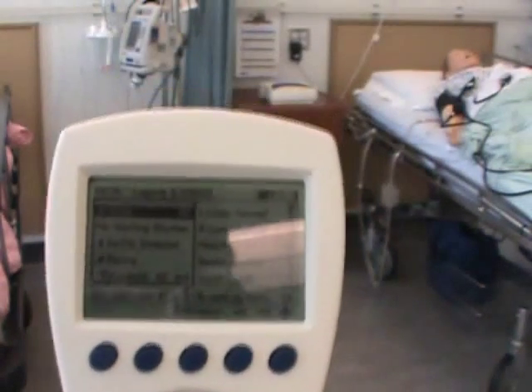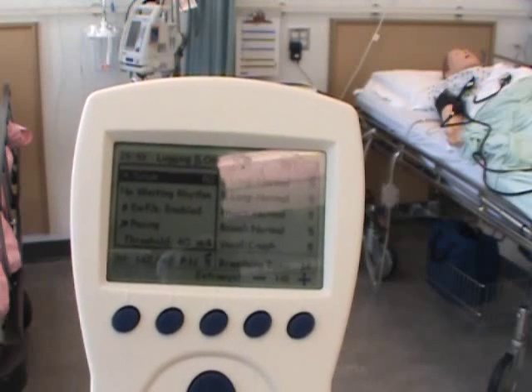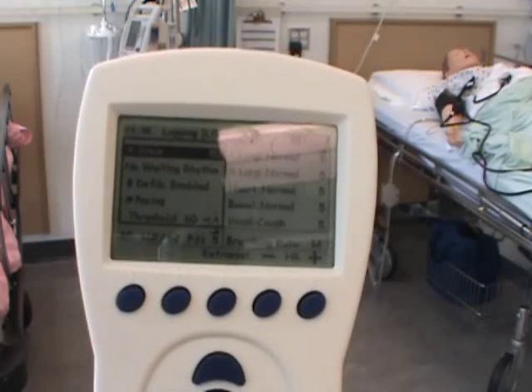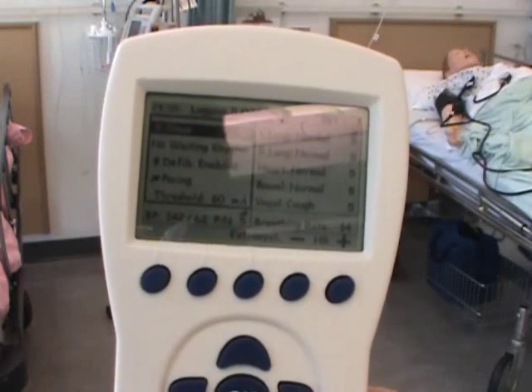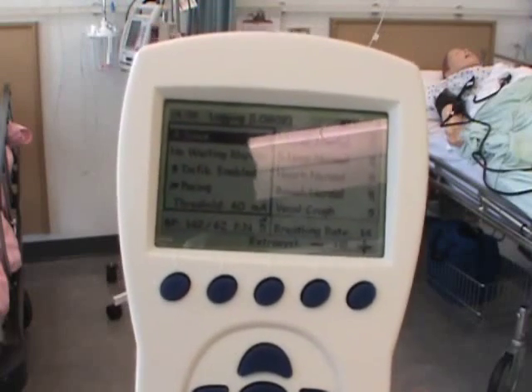The first thing we want to do before we have anyone measure vital signs is calibrate the blood pressure cuff. If the blood pressure cuff is not calibrated properly, there's a good chance that blood pressure readings will not be in agreeance with the ones you program into the machine. Let me show you how to calibrate the cuff and I'll explain.